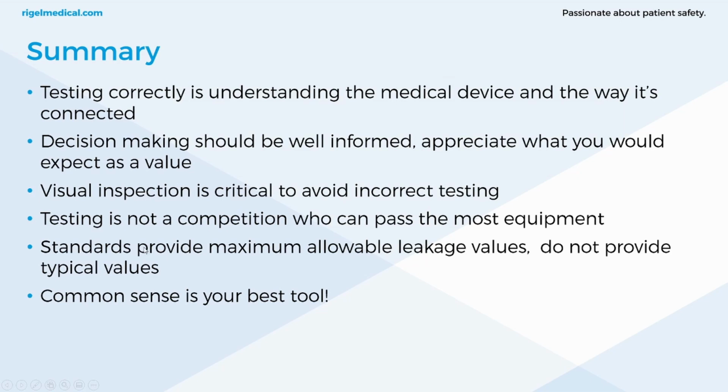Testing is not a competition of who can pass the most equipment. Safety of devices is what's paramount. Standards provide maximum allowable leakage values. They do not provide typical values. But with common sense and experience, these expected values will become second nature. I can't reiterate enough that common sense is your best tool. It really helps within the field of electrical safety.